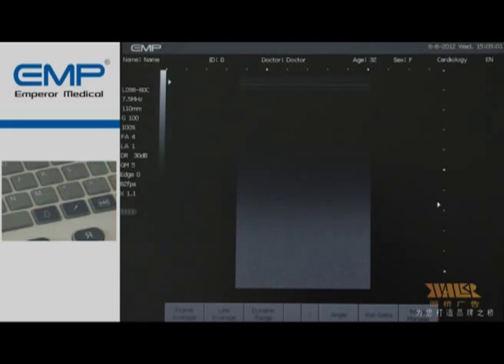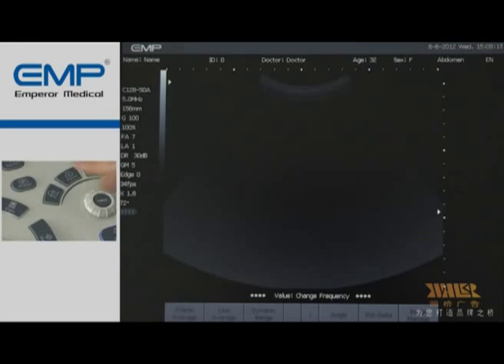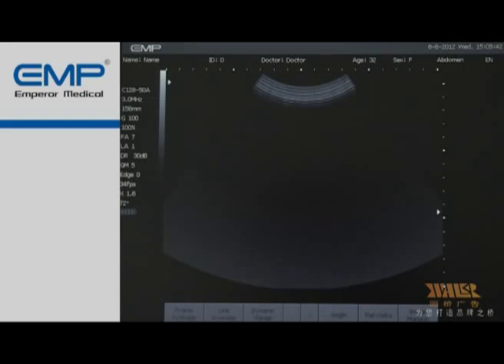Then press the Probe button. You can switch between the probes connected to the system. Press the Frequency button and then turn the value key to switch probe frequency. The main menu of the screen menu area has several pages in real time state. Pages can be switched by pressing the turnover button.